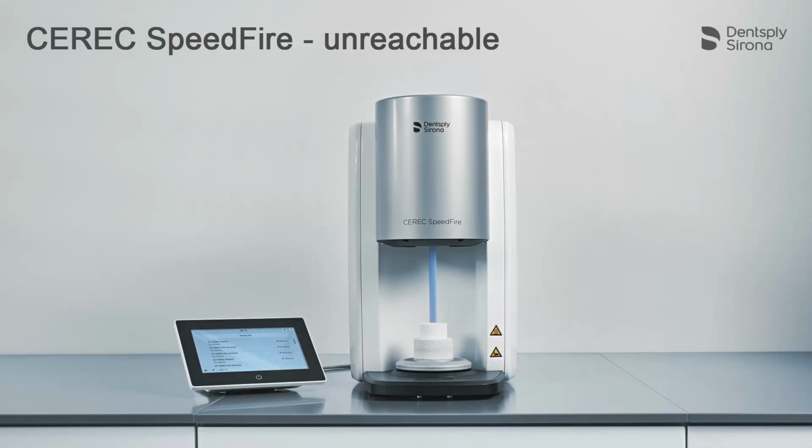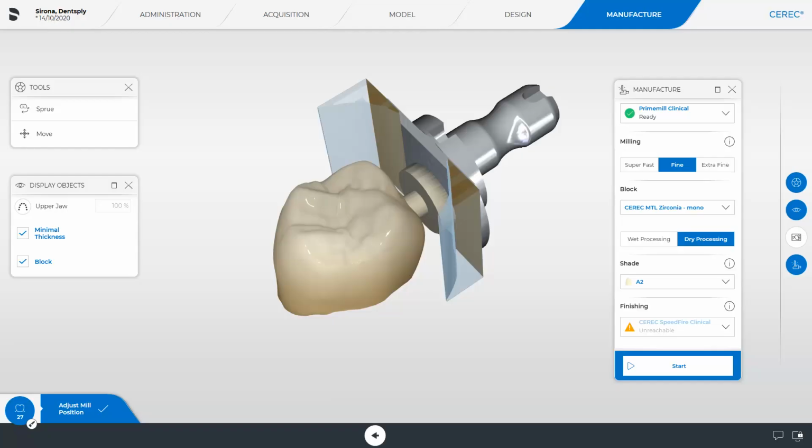Now we will look at the different reasons that may cause the CEREC software to display CEREC SpeedFire as unreachable. We are back in the CEREC software manufacture phase once again and see that the same warning is again displayed under Manufacture. One reason for this could be a missing network connection to the selected CEREC SpeedFire. In this case, however, there is a different reason. The selected CEREC SpeedFire is turned off. The firing order can only be transmitted to a CEREC SpeedFire when it is turned on.